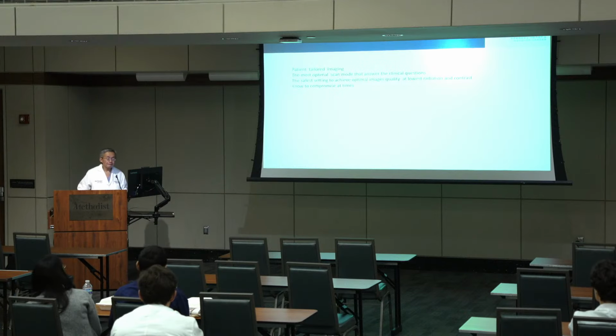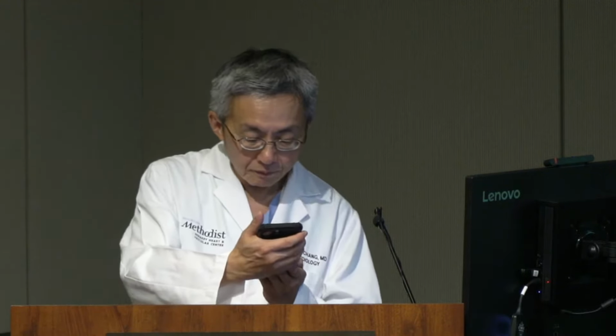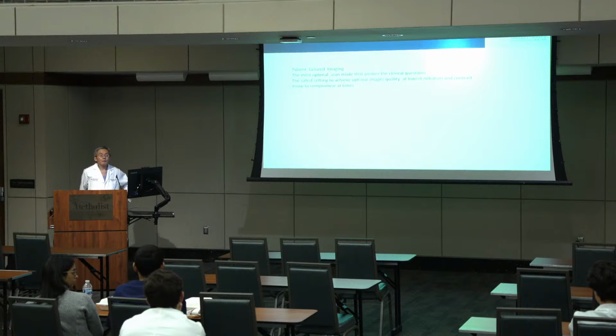Go ahead. Yes, one question that comes up a lot on general concepts is when we're ordering cardiac CTs, for example with the coronaries, oftentimes I know we use contrast quite a bit to help differentiate these morphologically, and I think you alluded to that in your talk. When do we ever not use contrast in those protocols, and are there times when we want to avoid it other than things like ESRD and kidney disease? If you want to evaluate the coronary lumen, you need contrast.